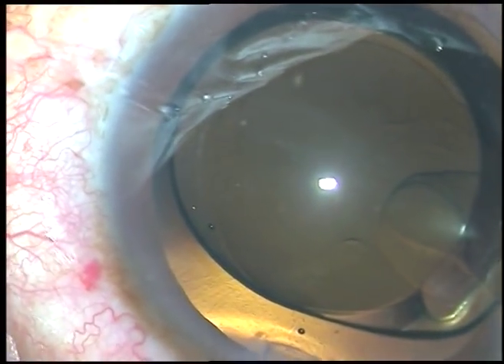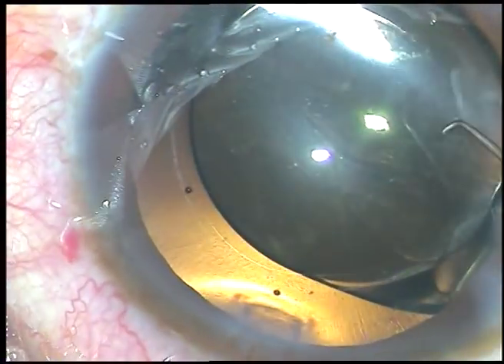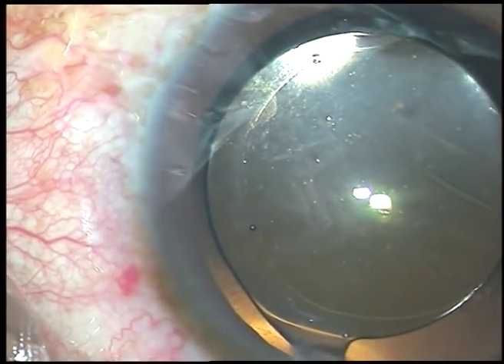Since the rhexis is of adequate size, you can see that the optic of the IOL will be nicely covered by a rim of anterior capsule all around.